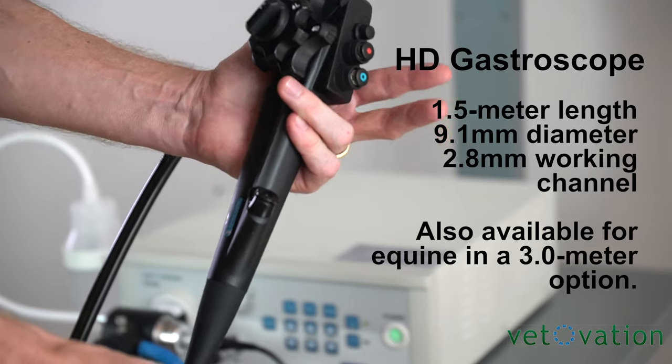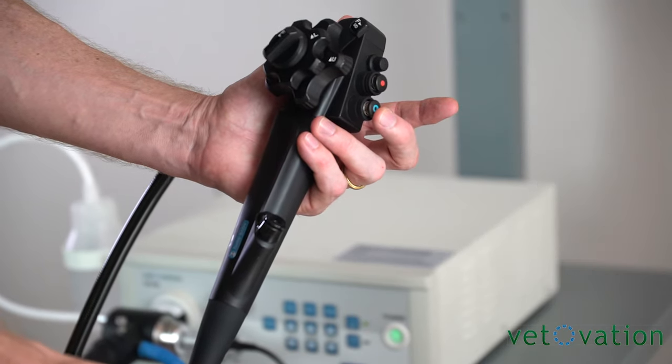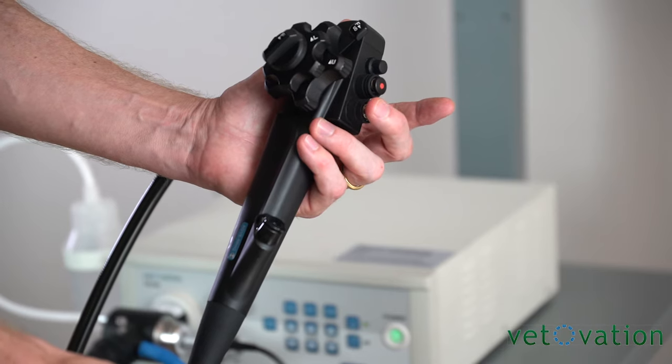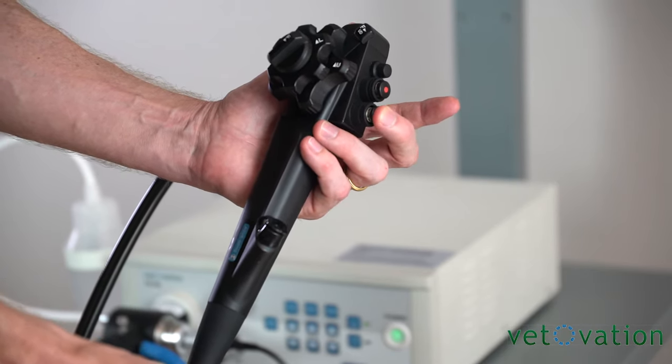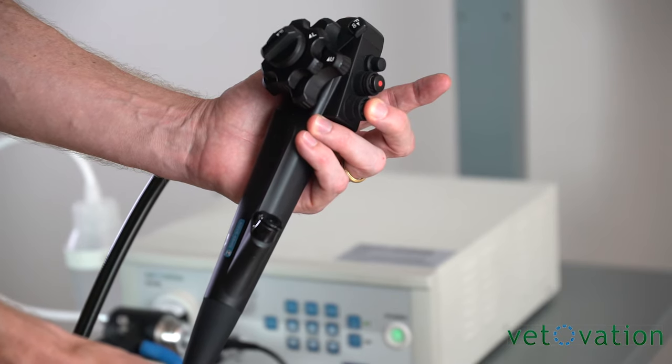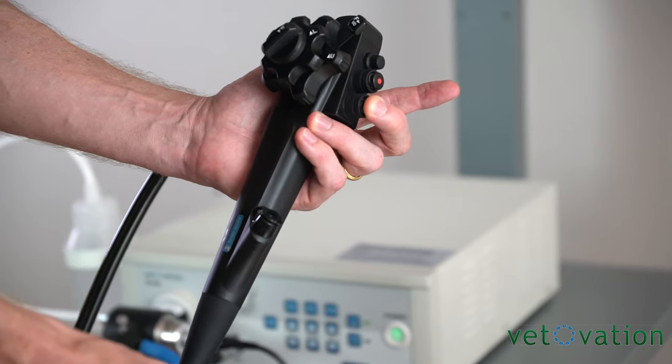Most people will hold the gastroscope in their left hand. That gives you easy control of the blue button which controls air going into the stomach to distend the stomach and give you a working space. If you just depress the blue button that will then give you fluid across the tip of the scope. If it gets smudged you can wipe it off.